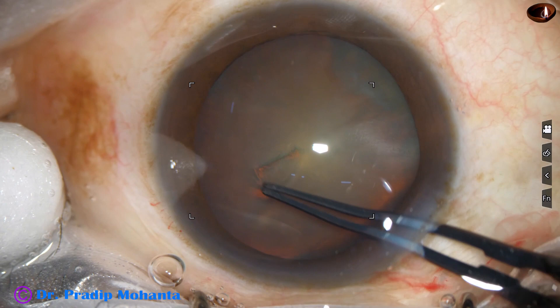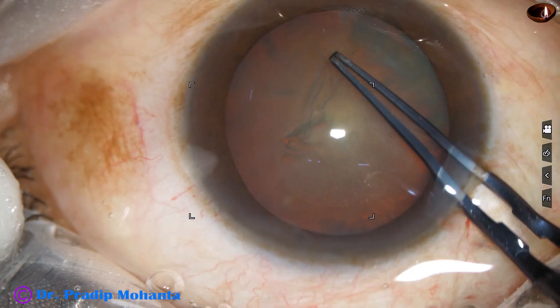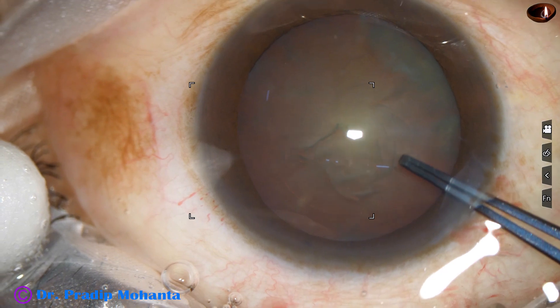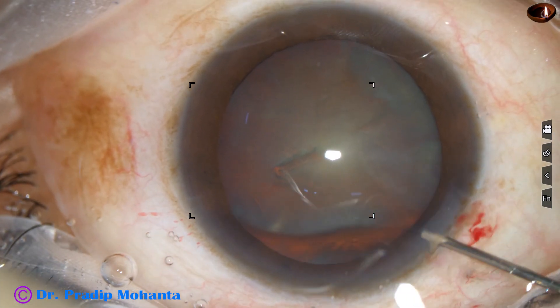Capsulorrhexis is done with utereta forceps. The capsular tag is raised and guided anticlockwise all around. An adequate sized rhexis of about 5.5 mm is done.